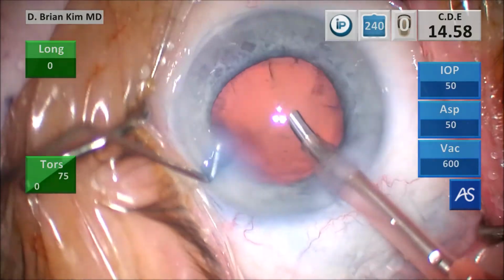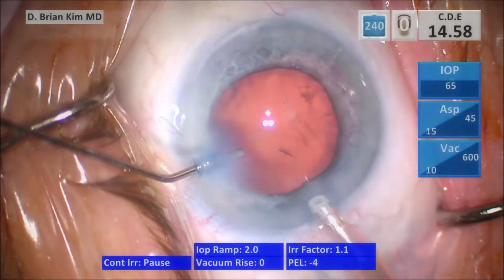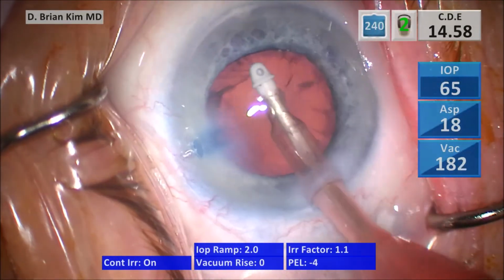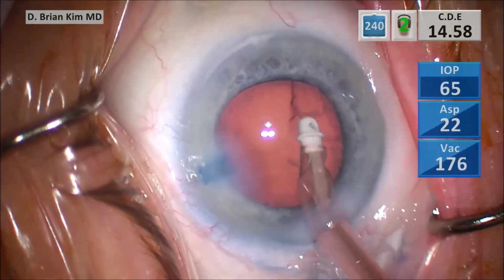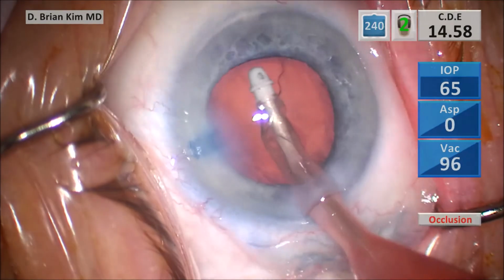So I take the chopper out, push BSS in, take the phaco tip out, and I go in with the I/A handpiece. Again, you can see there's no epinucleus. There's hardly any cortex. And so I'm just removing some of that peripheral wispy lens material.